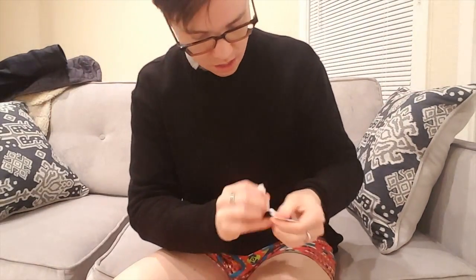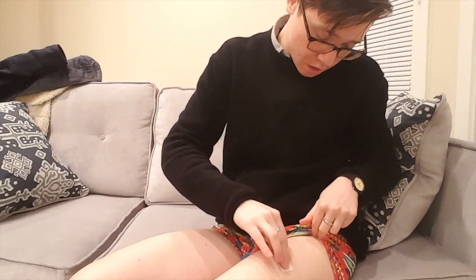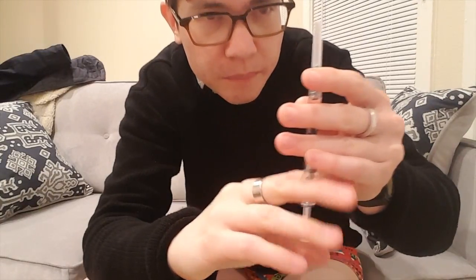Okay, so I'm going to put this down for a second. And I'm going to take my pants off. Clean my left leg. Let it dry out a little bit. Now I'm going to get this all the way up to the top so that there's no air left in the needle. Until we just see a little tiny bubble come up at the top of the needle, and then we're ready to go.